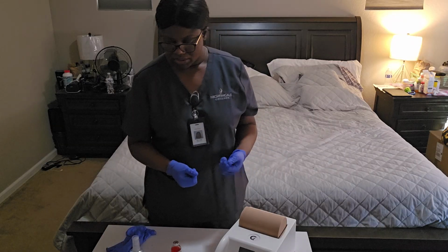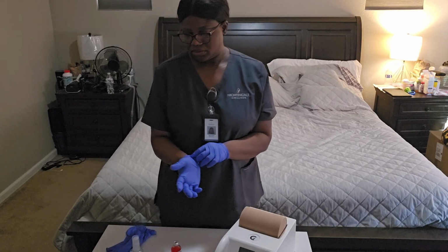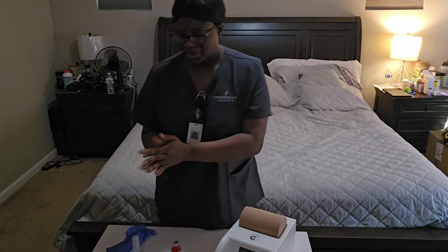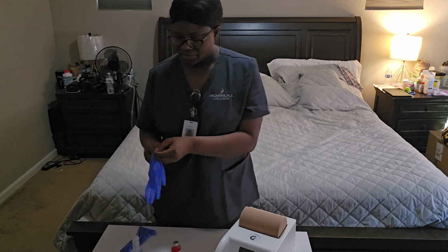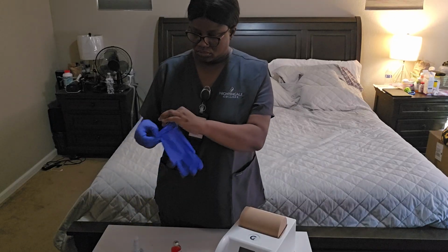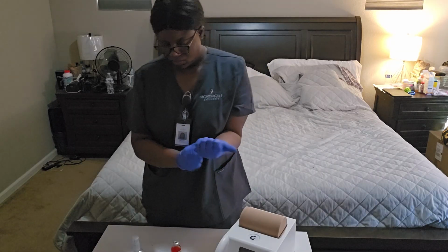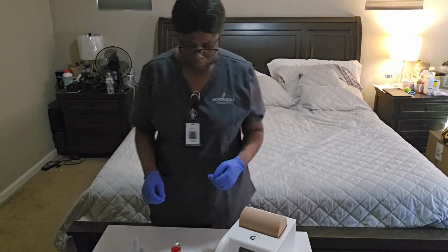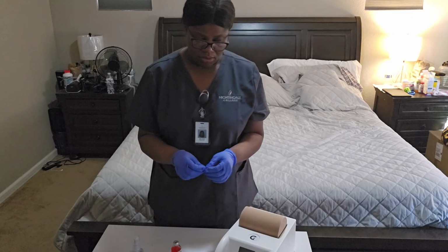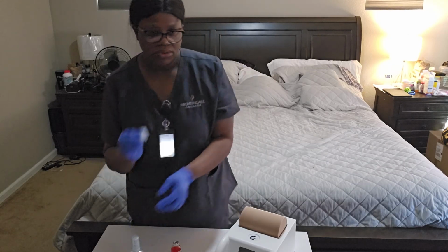Okay, so what's next I'm going to do is take off my gloves. I'm going to perform hand hygiene. I'm going to put on new gloves. So what next I'm going to do is clean the site with an alcohol swab. I'm going to clean the site with the alcohol swab.